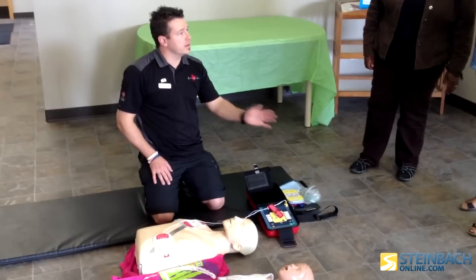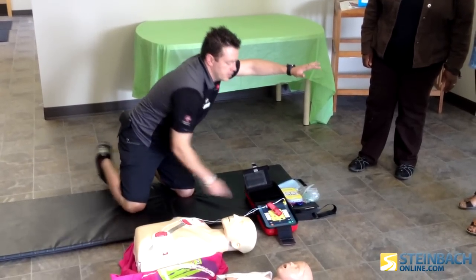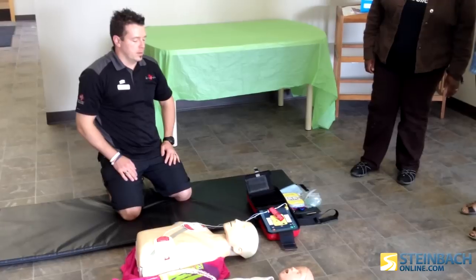Make sure everyone is clear. I'm clear. We're all clear. Press the shock button. Shock delivered. Be sure emergency medical services have been called.